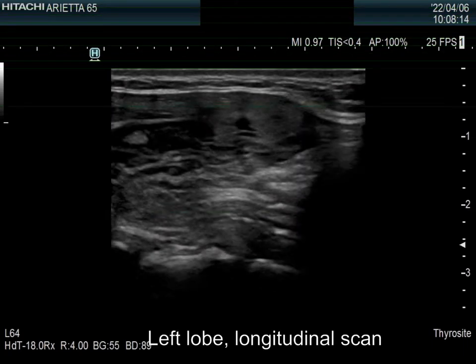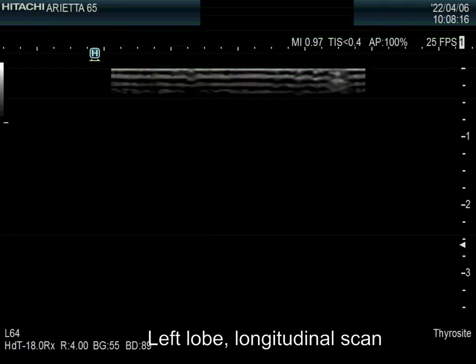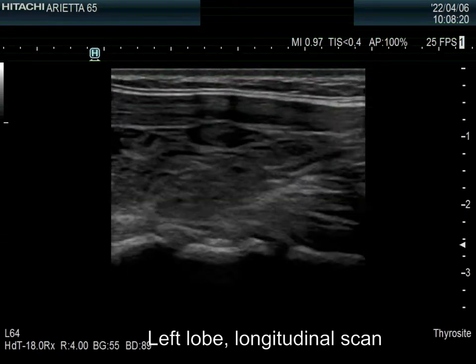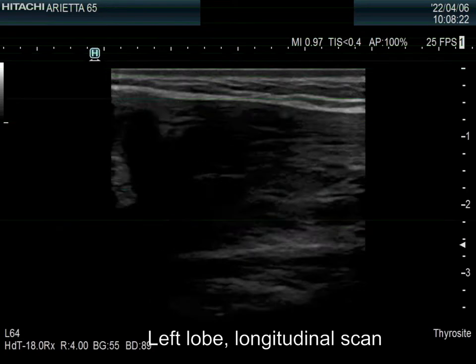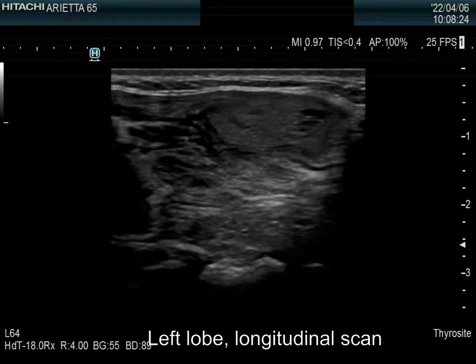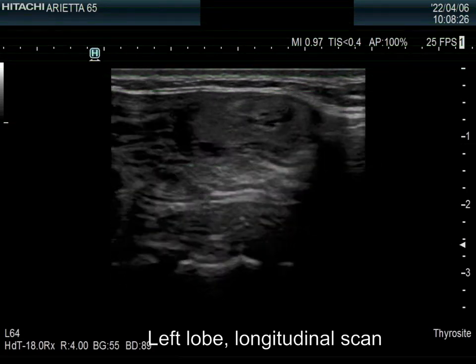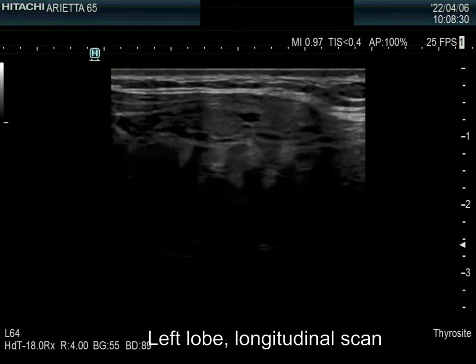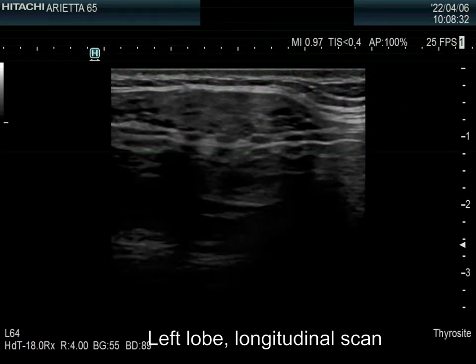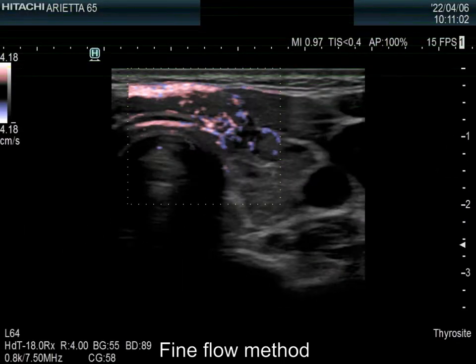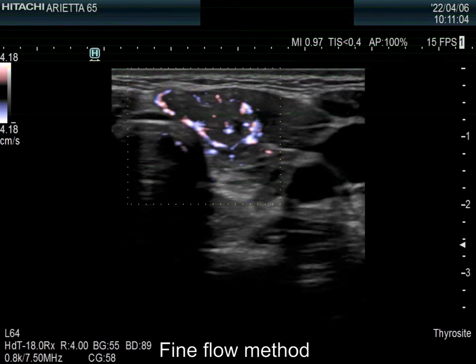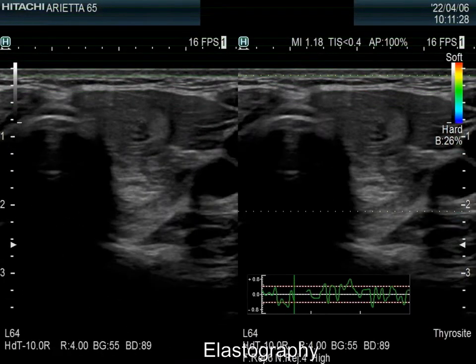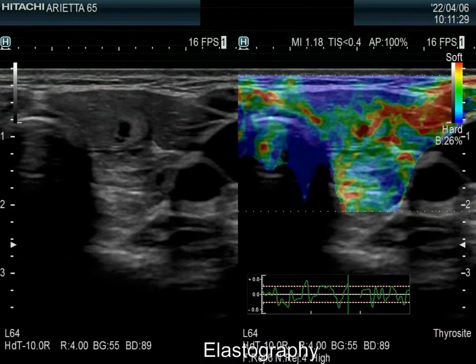There is a minimally hypoechoic nodule in the ventromedial part of the lobe. The lesion presents bright echogenic spots. Perinodular blood flow predominates, but intranodular vascularity is also present. The elastography pattern is not specific.